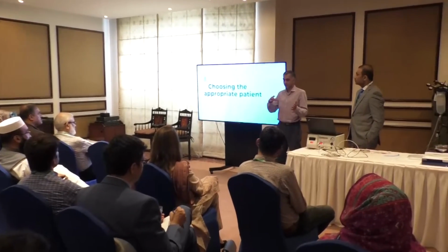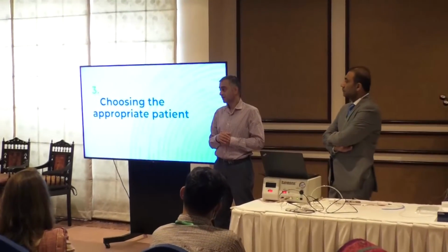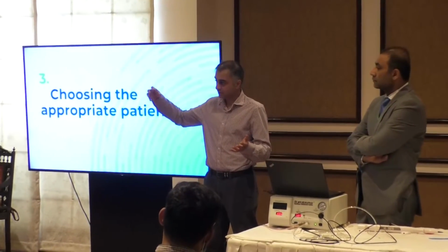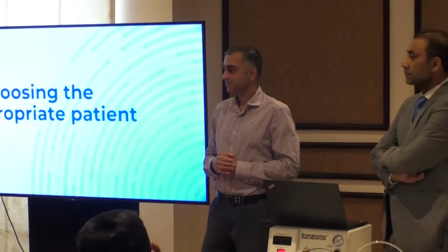Because remember, when you're burring, what you don't really want to do is to burr within the guide, because you might shave off some of the inside of the guide. So you have the guide catheter backed out and have a good run into the lesion. Sir, we can use floppy? You can use floppy. Safely to use extra? Yes, I prefer in those situations to use extra support.